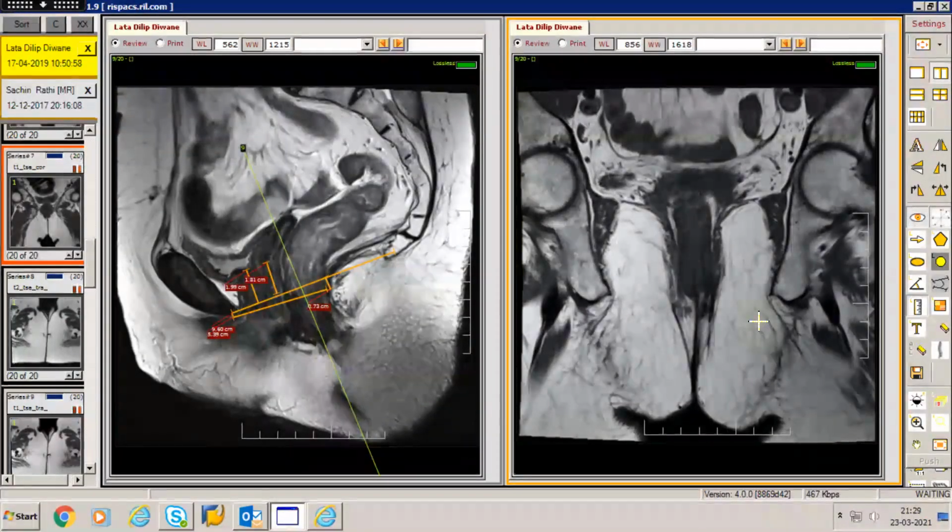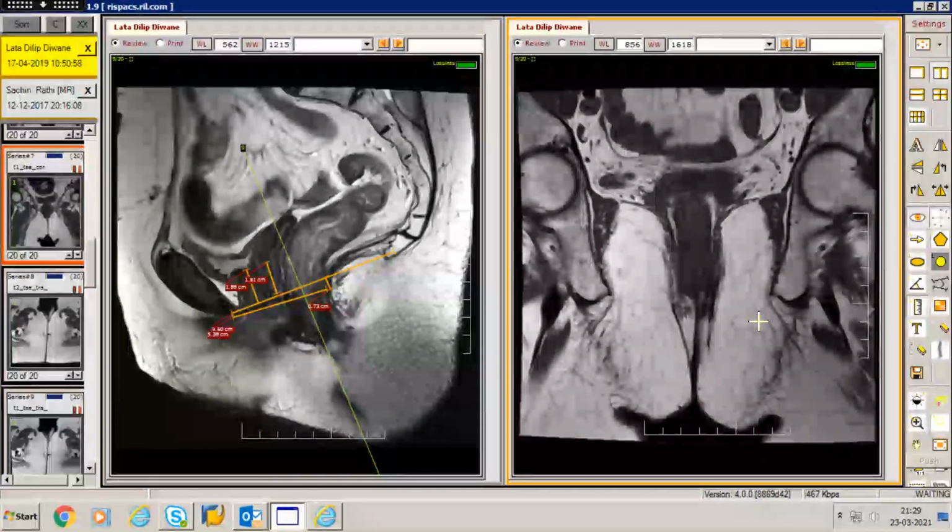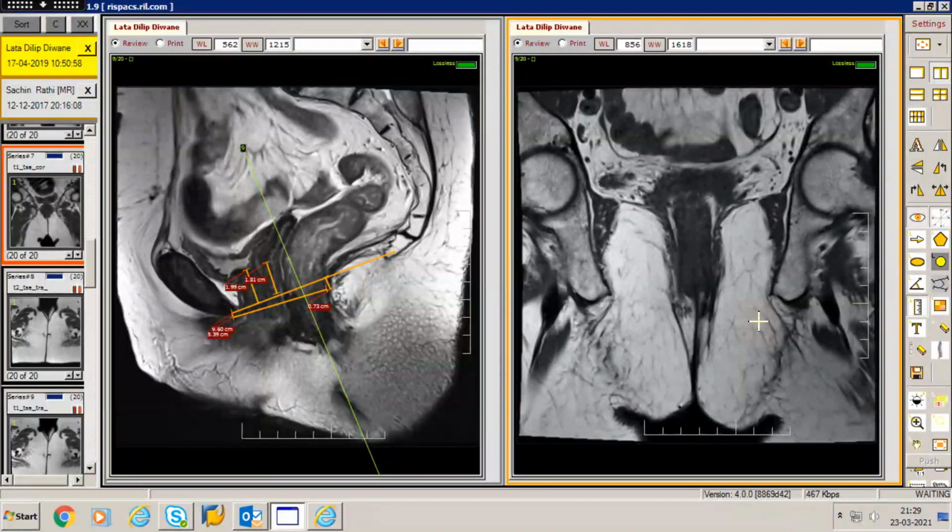The third point, which I want to always make, is that even if you don't have the PCL, you should never see the bladder neck or the anterior fornix at the level of the lower margin of the pubic symphysis. They are never subpubic. So any of these structures being subpubic in location or just at the inferior edge means that the anterior and the mid compartment are definitely lax. So those are just standard lines which you can use. You should never see these structures in a subpubic location.